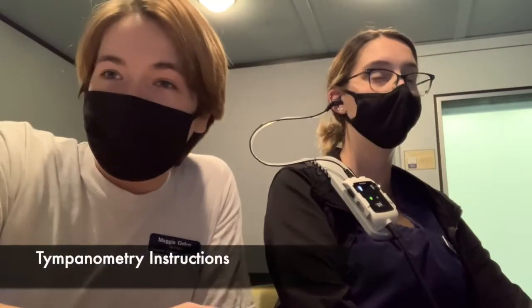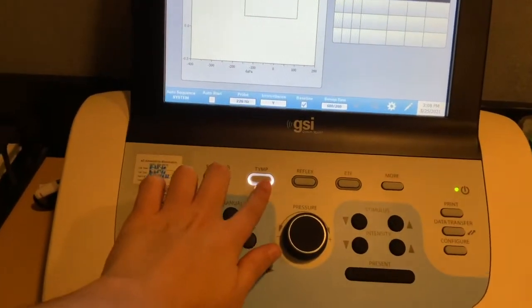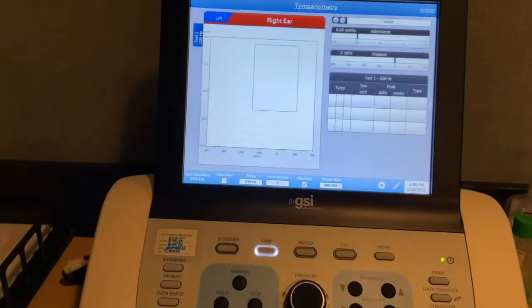When doing tympanometry, you'll want to let the client know that they will feel some pressure in their ear and they'll hear some sounds, but it shouldn't hurt and it will be over momentarily. So I'm going to go ahead and begin in Emily's right ear. To begin tympanometry, you want to make sure that the tymp setting is selected on the admittance bridge, and then you're going to hit the start button on the left to begin the test.